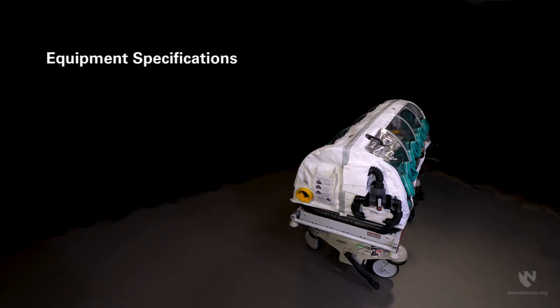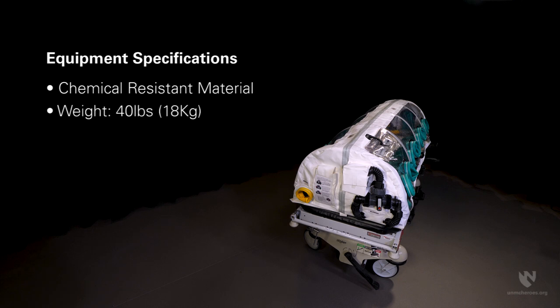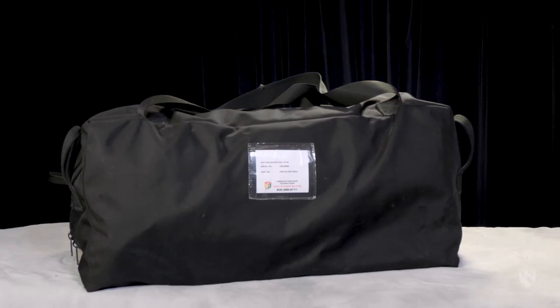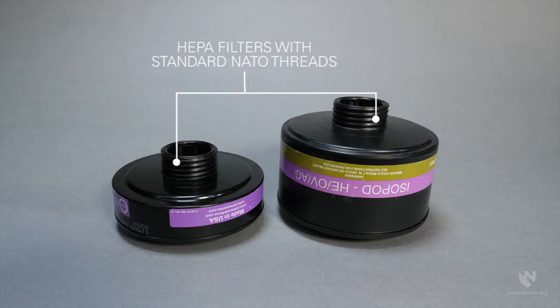The ChemBio isopod is constructed of materials resistant to chemicals and weighs 40 pounds. Its overall dimensions when assembled are 87 inches long by 27.5 inches wide by 18.5 inches high, allowing it to fit on a hospital cart or gurney. It is contained in a single duffel bag, enhancing portability. The unit is equipped with HEPA and HEPA OVAG filters using standard NATO threads for ease of replacement.